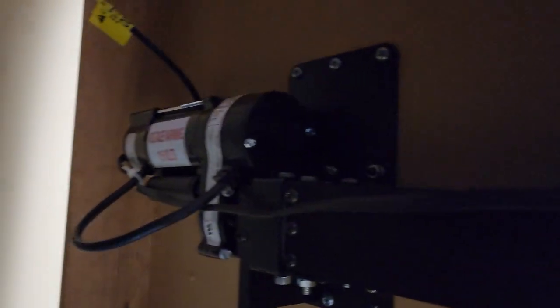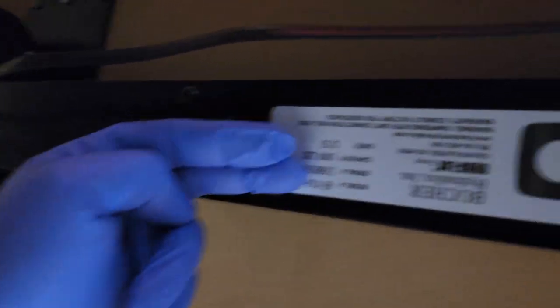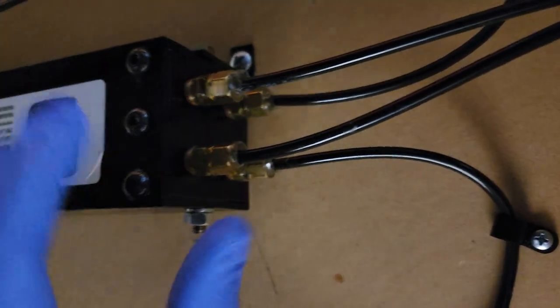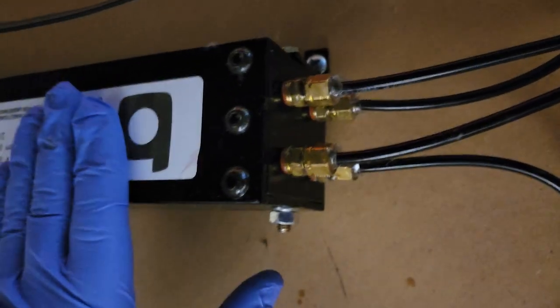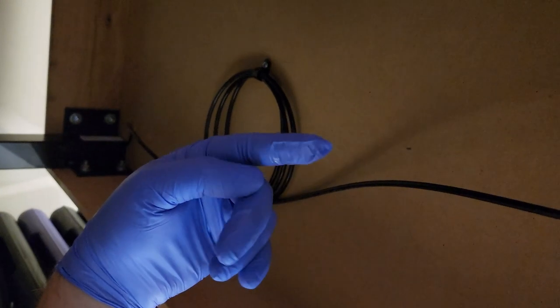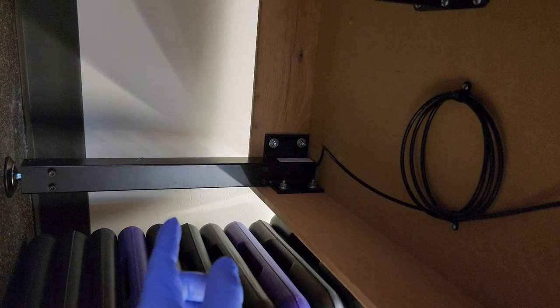All right, so here's a hydraulic pump. This is basically a piston and it just squeezes down. And technically, each one of these ports right here should have an equal amount of pressure, and it should be an astronomical amount of pressure based on the diameter of the supposed push piston. So you can see right here that they all come out and there's plenty of extra line and they run down, and that's the problem child right there. There is a high-low switch down at the other end. It activates, and when it activates, these guys should go up and down.